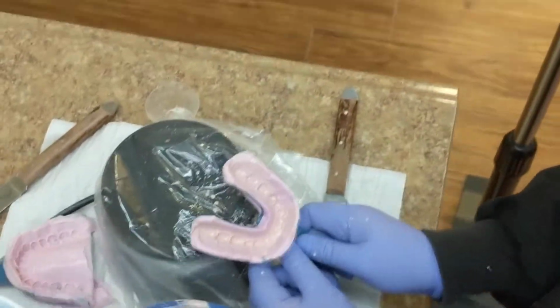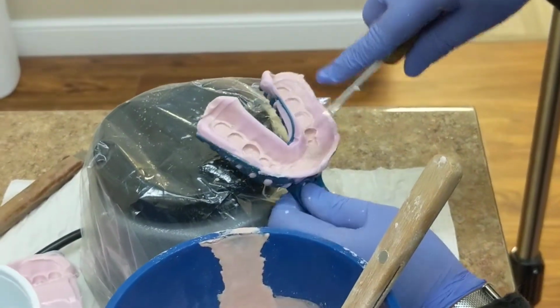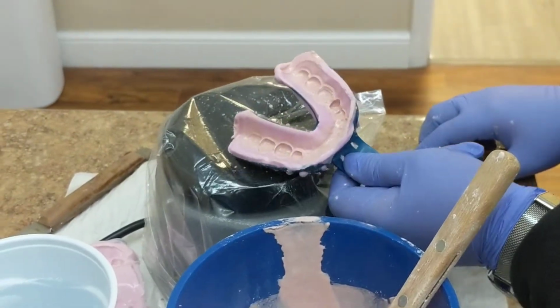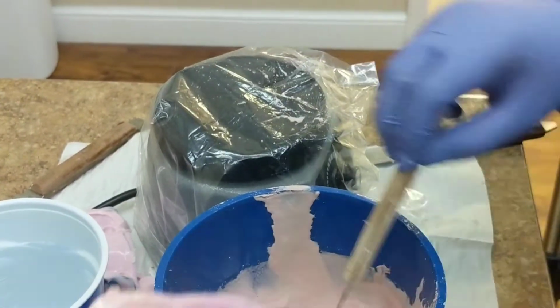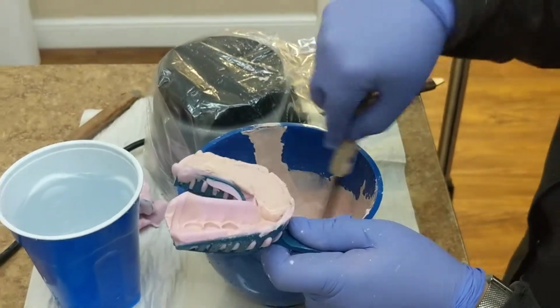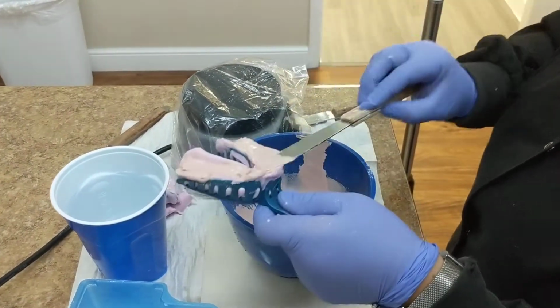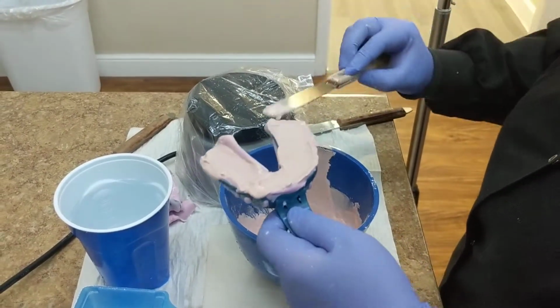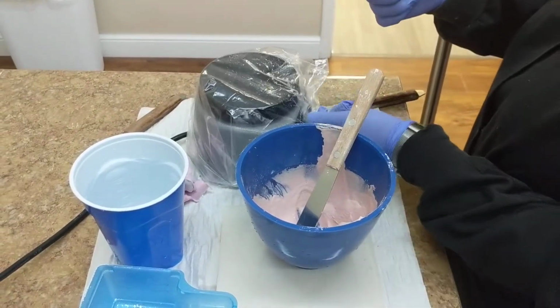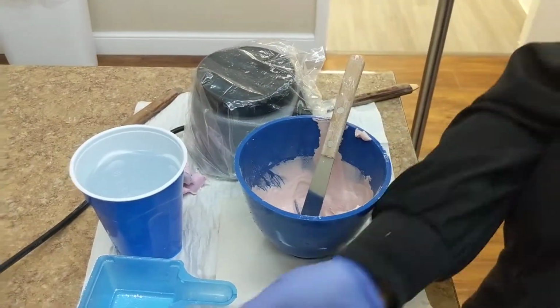Okay, now I have my first layer nice and coated without bubbles. Now I'm going to do the second one. The second one, you apply the stone without vibrating it. Just go all the way around, covering everything all the way to the top of the tray, and then you vibrate for half a second, and then that's that. Now we are going to create the third layer, which is the base.